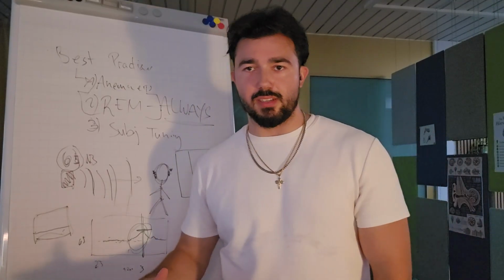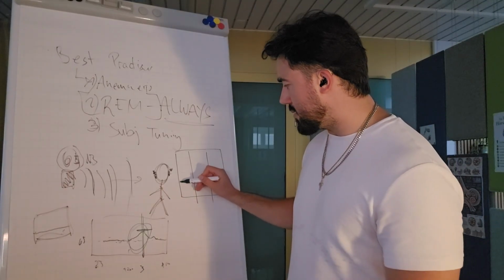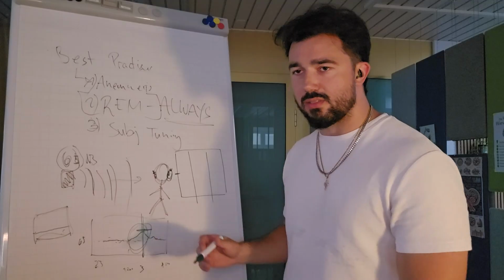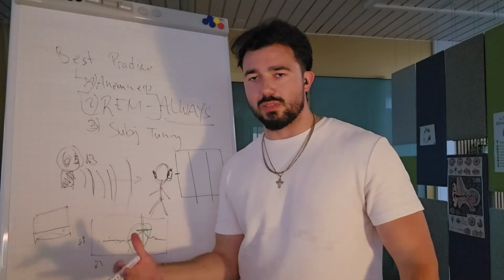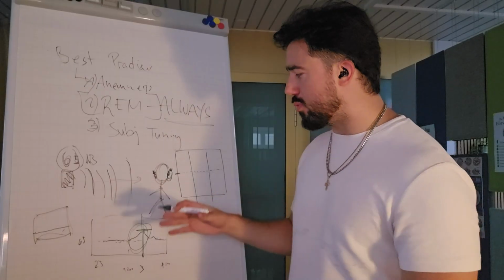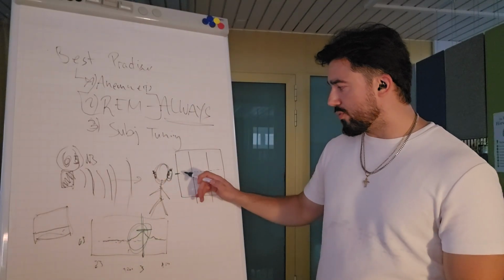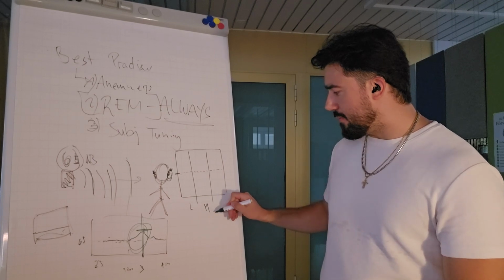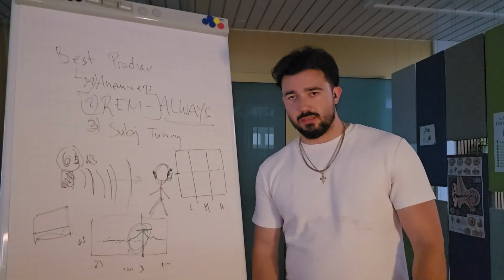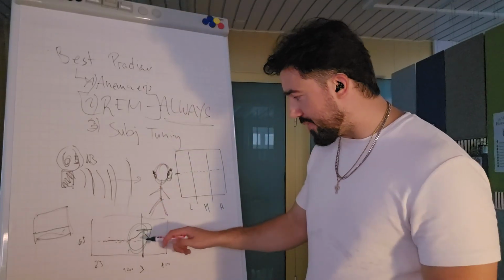Let's say here in the middle is 0. That would be optimal hearing, optimal sound quality. You want to be here. You would hope, okay, I'm gonna put this in, my sound will be balanced. I get the perfect amount of low, medium, and high frequencies, and then I'm just gonna have great speech understanding, great music, everything cool. Yeah, but that's not what happens, right?